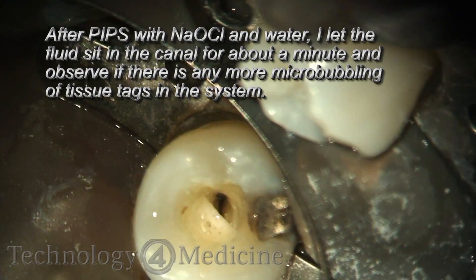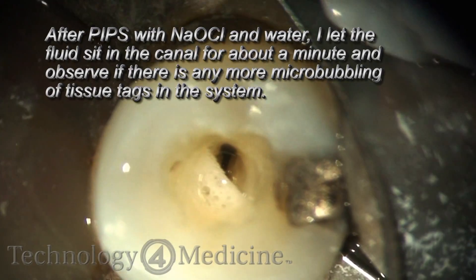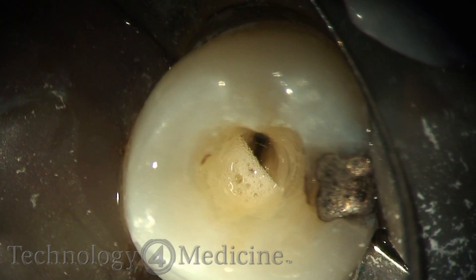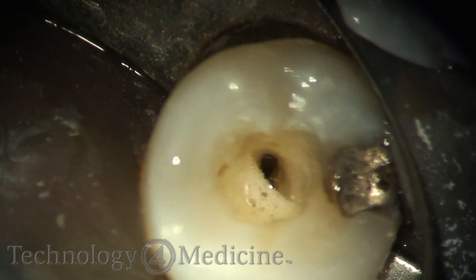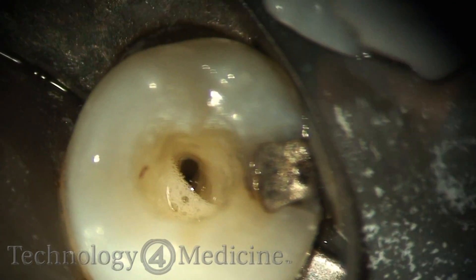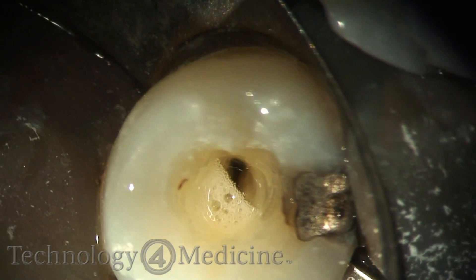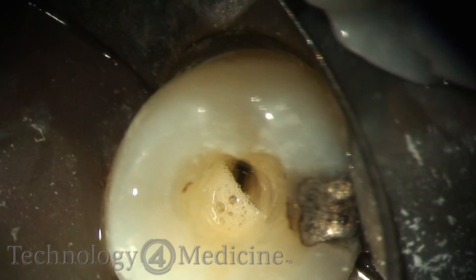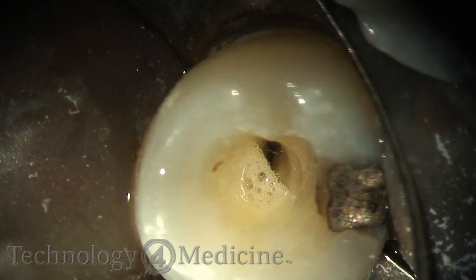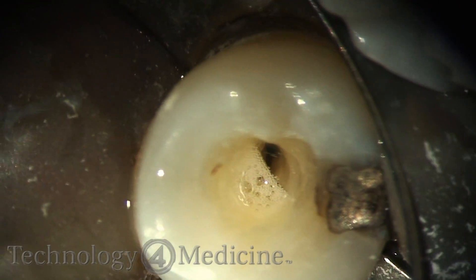Because we're using such low energies, there is no photothermal component to utilizing PIPS. It's just moving the fluid in three dimensions throughout the entire root canal system — canals, anastomoses, and lateral canals. You'll see here I'm allowing the micro-bubbling to occur with the sodium hypochlorite dissolving tissue tags. You're probably thinking you can do this utilizing ultrasonics, but the repetition rate with ultrasonics is so fast and the heat generation so high that you don't get the three-dimensional fluid movement with ultrasonics that you do get with lasers using photoacoustic streaming or PIPS. It's the perfect energy source to move fluid in the root canal system.